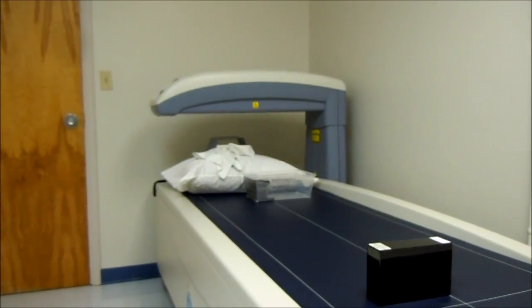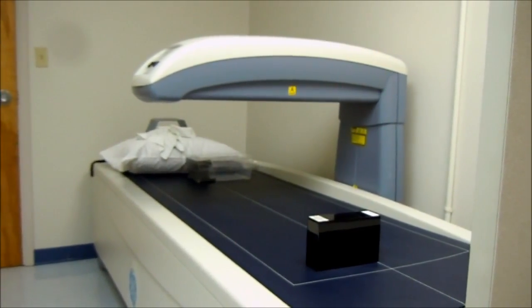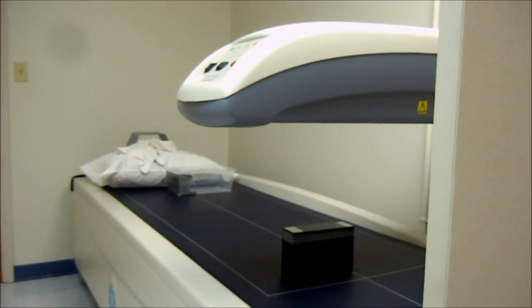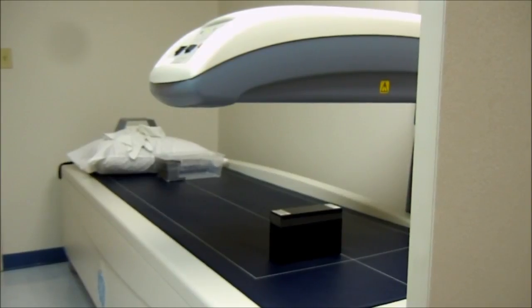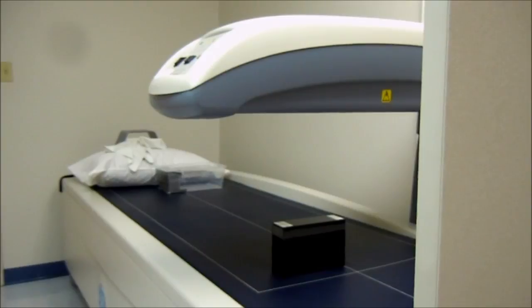Running diagnostics, and it's coming back. Now it's checking the actual detector. It's running through a series of diagnostic tests. You can see right now it's acquiring the counts that it needs.